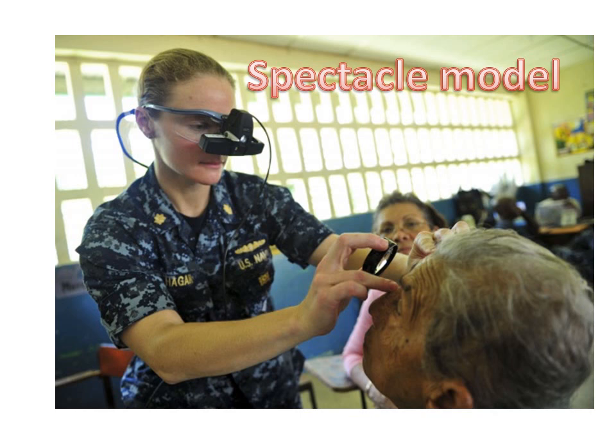binocular indirect ophthalmoscopy. This is another model which is known as the spectacle model of indirect ophthalmoscope. You must know that there are two models. One is the headband model, another one is the spectacle model. Here I am showing you the spectacle model. She is holding a 20D lens at a distance of around 2 inches from the patient and trying to visualize the image.